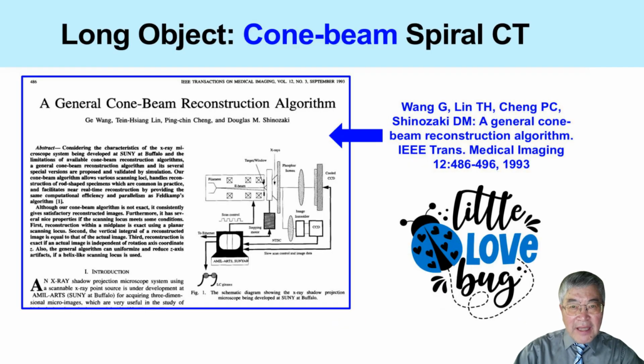In the early 1990s, I finished my PhD dissertation. My dissertation mainly addressed two reconstruction problems. The first one was the long object problem. In material science, many samples are elongated. They are not sphere-like objects that can be fully covered by cone beam projection.